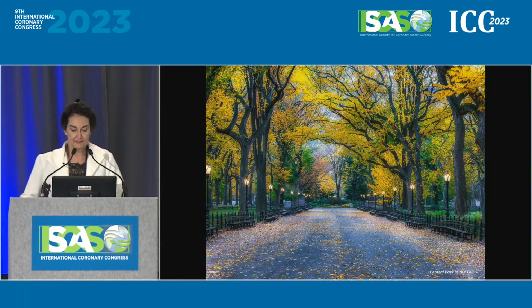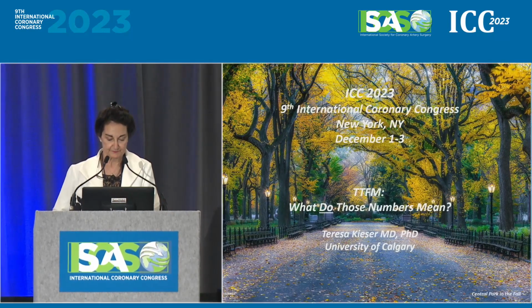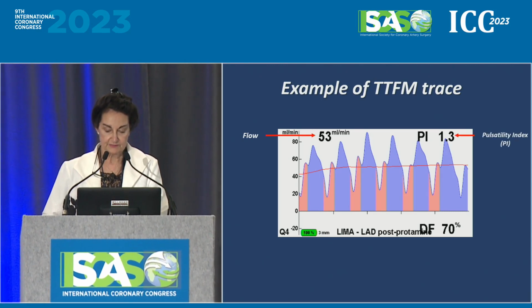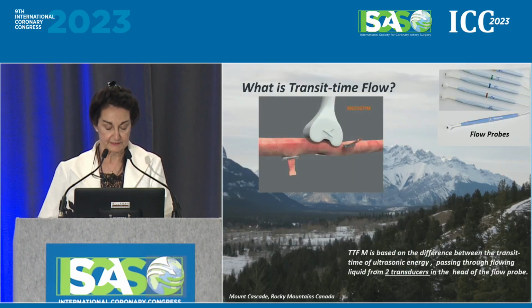Good afternoon, dear colleagues, ladies and gentlemen. We're going to talk today about what those numbers mean. I have been doing intraoperative graft assessment, TTFM, for 19 plus years, and epicardial ultrasound for 9 years, and these are my disclosures. We all know the numbers: flow, pulsatility index, diastolic filling. But the waveform is extremely important, so we're going to be including that.